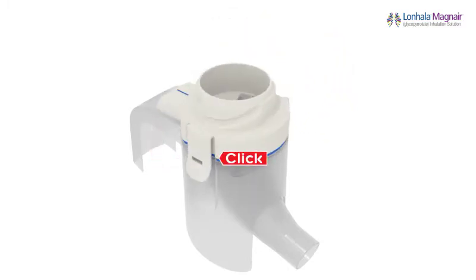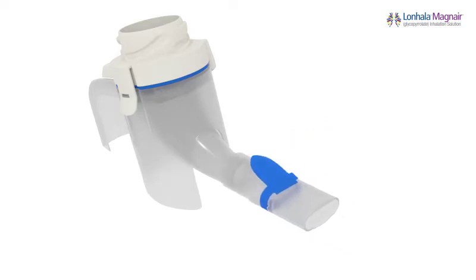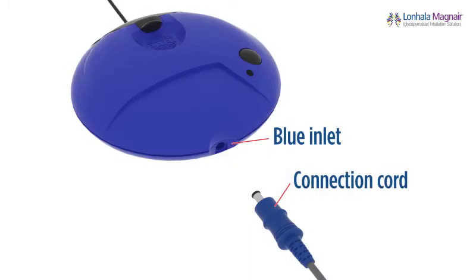You may hear a click. If you do not close your handset body completely or align the aerosol head correctly, your medication could leak and you will not get your full treatment. Be sure the blue valve is in place by pressing it down into the slot on the mouthpiece. Attach the mouthpiece to the handset body with the blue valve on top.